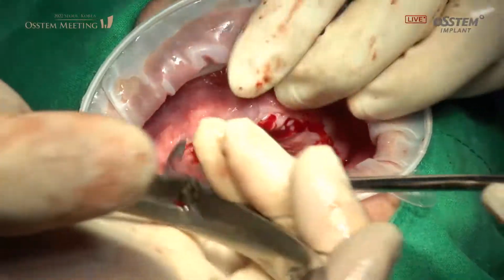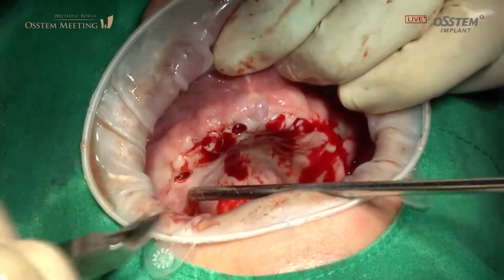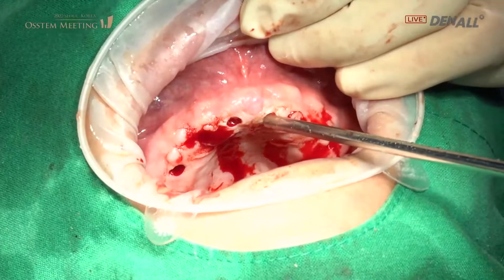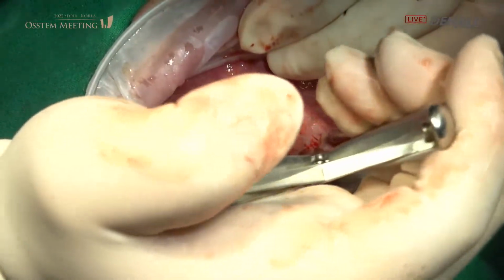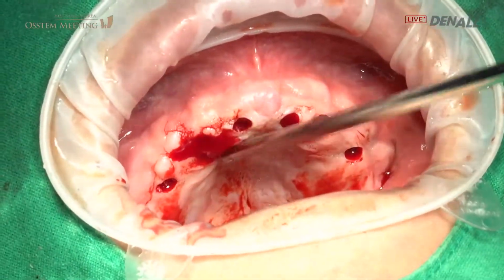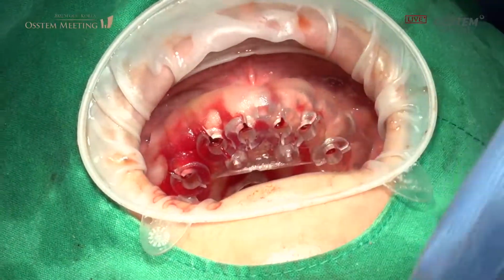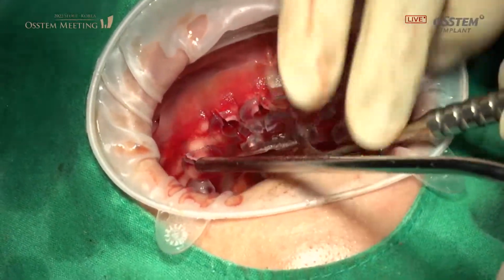The teeth are not good, so the patient's position is a little bit modified for better visibility. Now, the tissue punch is used to remove tissue, and the template is mounted again.